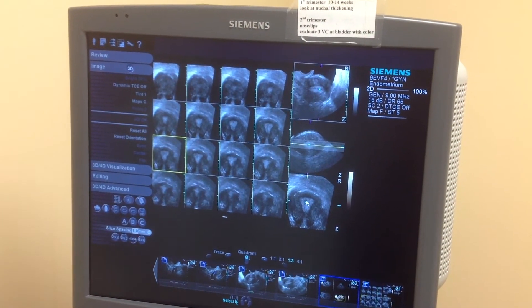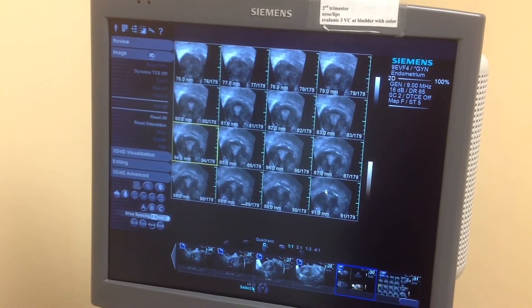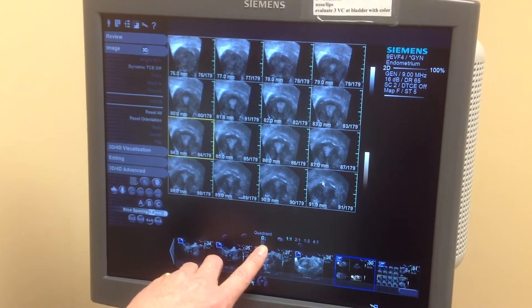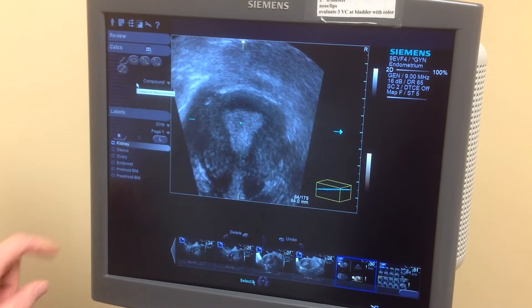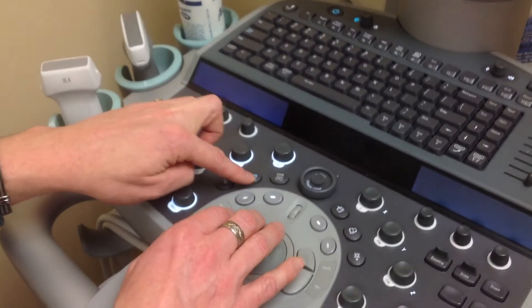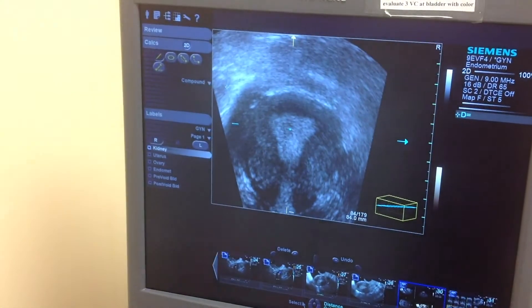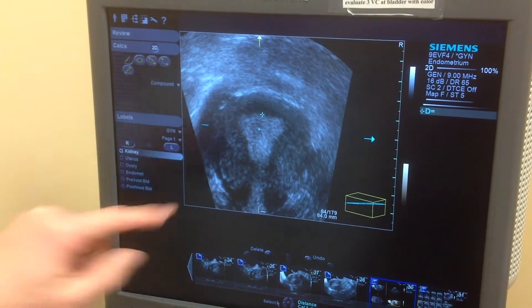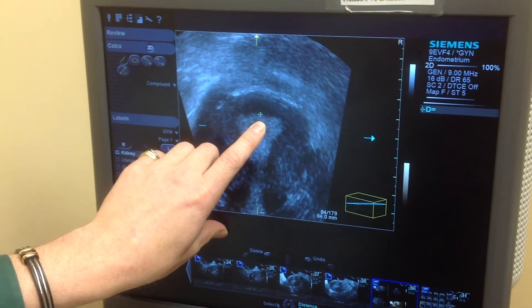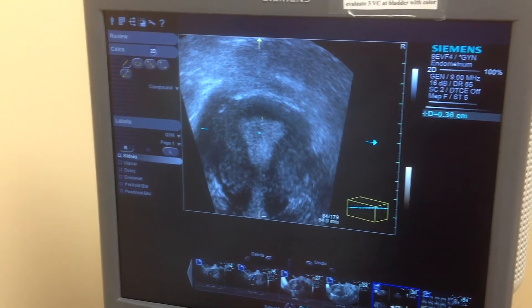Going back to a one-on-one view, let's try one more thing — I'm going to change back to my C quadrant. I hit the measure control here to activate measurements. Now I'm going to use a measurement, and if I wanted to measure where my IUD was from the wall, say the IUD was sitting in here, I can measure the distance of the IUD in that particular plane.